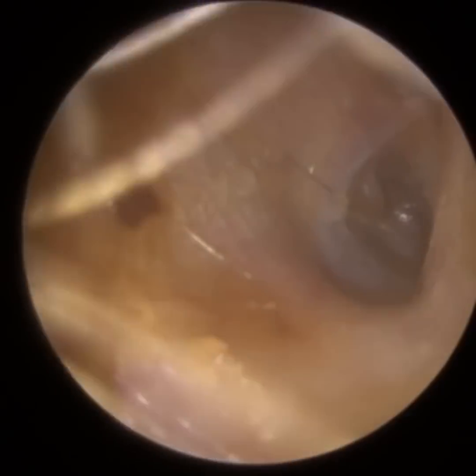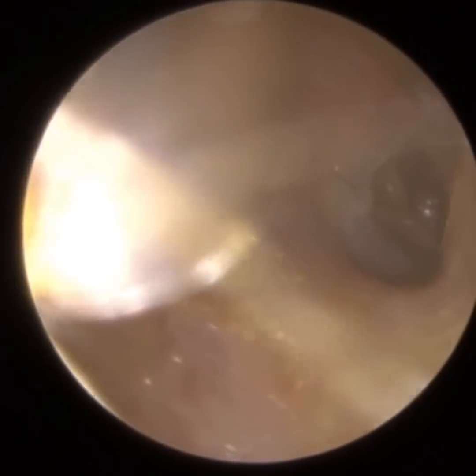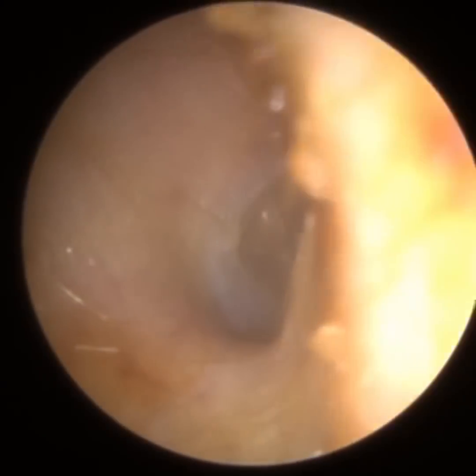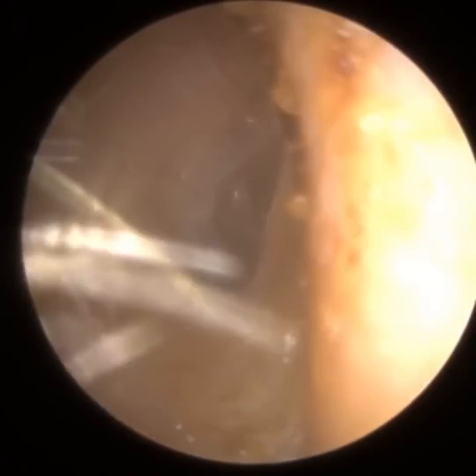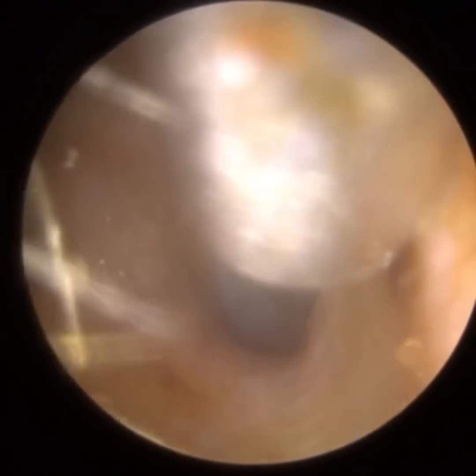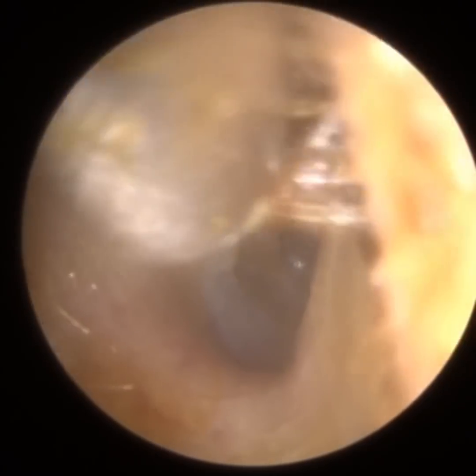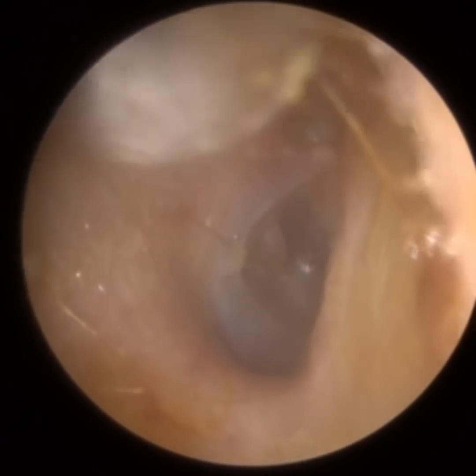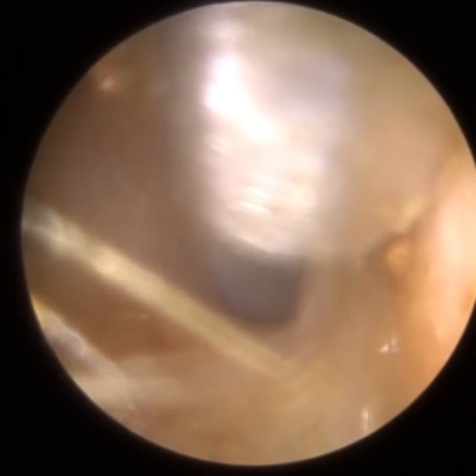So the eustachian tube equalises the air pressure. Typically, at a resting state, the eustachian tube is actually shut — that prevents infection travelling up from the back of the nose to the middle ear. It also stops your own voice and your heartbeat travelling up the eustachian tube. So it's normally shut under resting conditions, so you don't hear your internal respiratory sounds. During brief moments of swallowing, yawning, or chewing, the eustachian tube momentarily opens and equalises the air pressure.